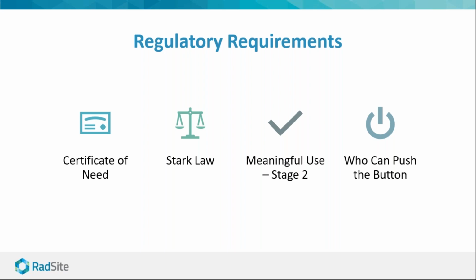Now, there are 3 states that it does apply to. So unfortunately, if you live in Michigan, Connecticut, or Virginia, there's going to be a certificate of need process to wade through. In our experience, we've been successful in Virginia, but it does add cost and a lot of time to the purchase. Michigan and Connecticut, unfortunately, are all but impossible. But again, this only applies to ENT. A lot of certificate of need requirements now have separate exceptions for dental, and then different requirements for different medical use. So that varies by state now.